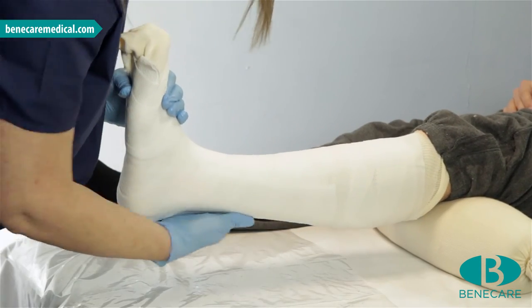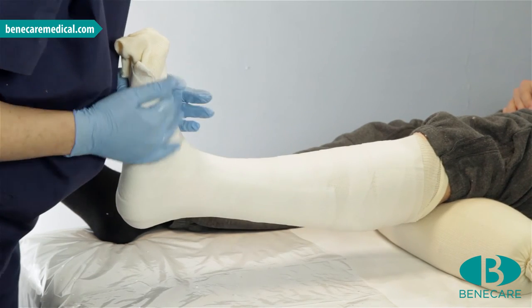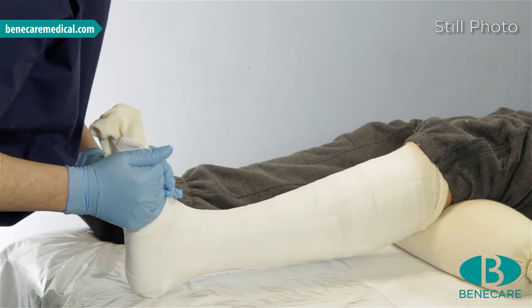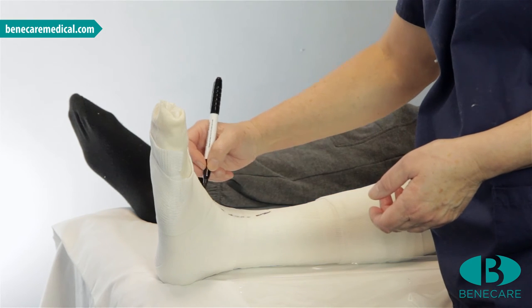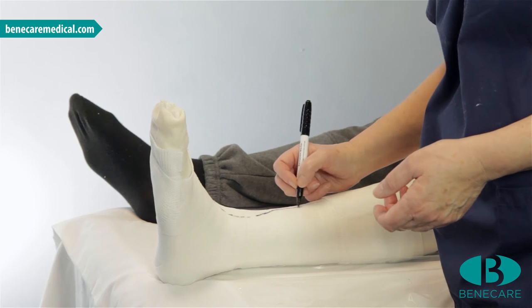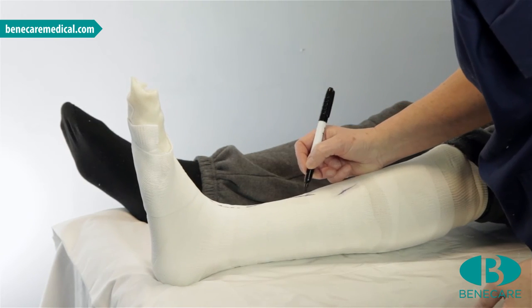At approximately 4–5 minutes, the cast has reached the initial set time. You may now rest the limb on a pillow or soft bed. Using a pencil — I have used a marker pen for demonstration purposes only — draw a lazy S along the anterior aspect of the leg. I prefer to start with a curve at the ankle.